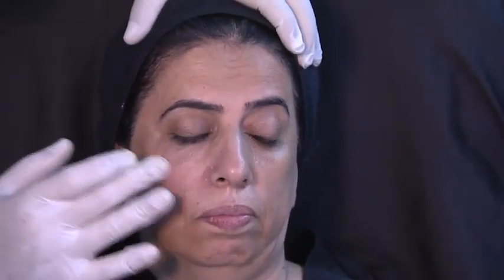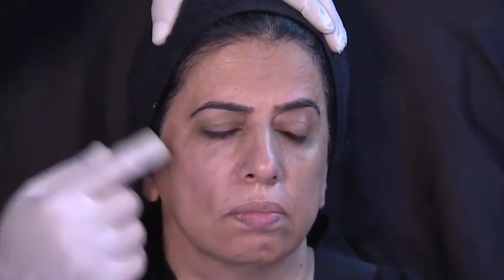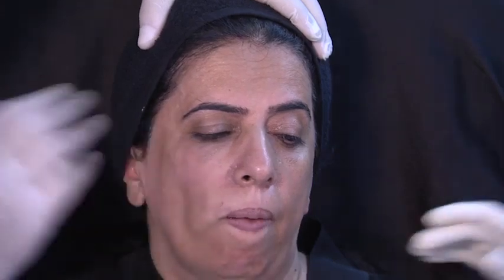Right, combination: lifting area, define for projection, volume deep, refine a little bit more superficial, and my Vital Light for the tear trough in a complex patient that needs a little bit of everything. But this is the reason. If at the end you are going to open 3 or 4 or 5 mLs for this patient, why are you going to open only one type of product when we can open 4 or 5 mLs and personalize which area we want? Okay, look at the camera. This needs to be molded a little bit. Victoria is going to do that, but I think it's a good result. It is, especially that this particular patient is relatable to this region and area.